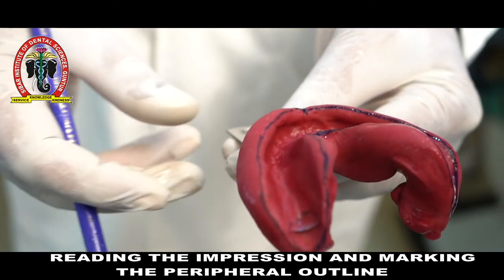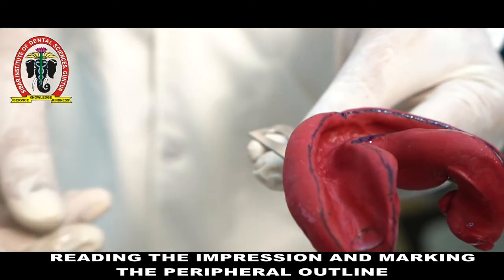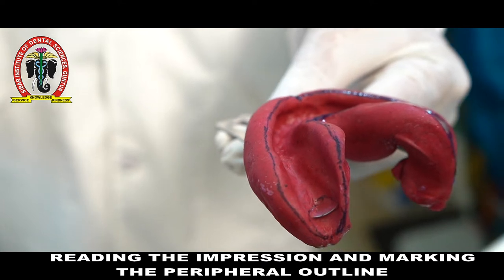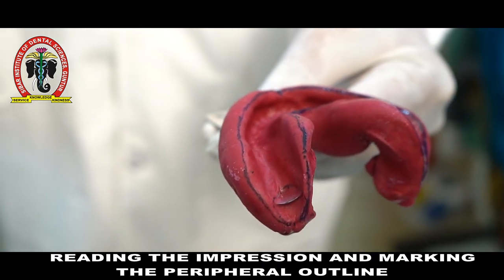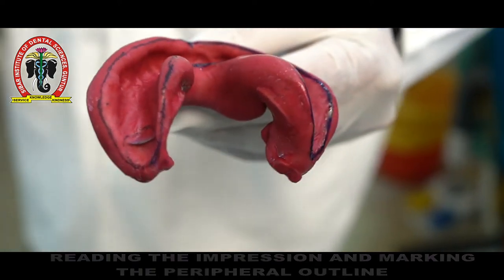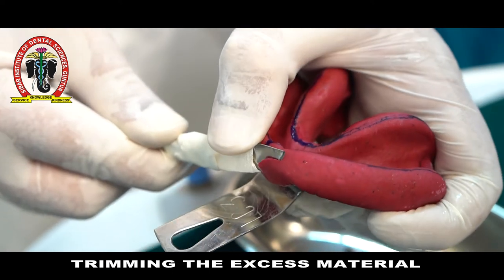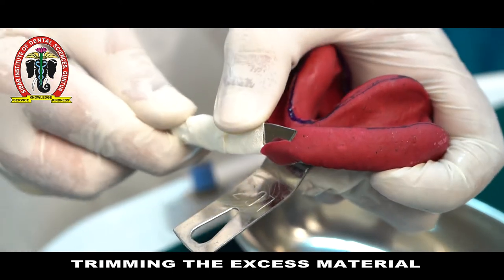Excess material can be removed by using a BP knife or a Stanley knife. Pass it over the flame and refine the borders — the excess material is removed using the BP knife.